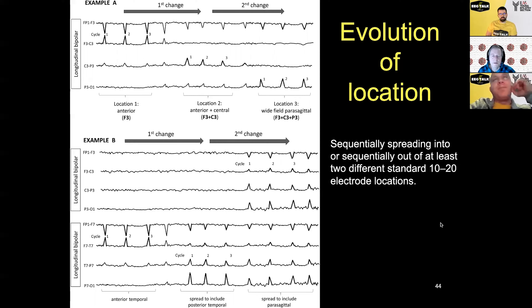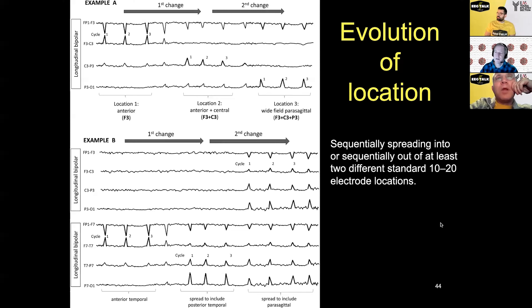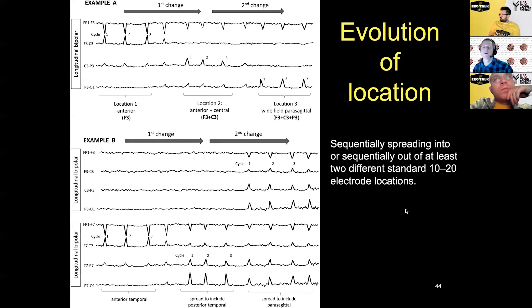Here's another example where the pattern spreads to the other side. We wouldn't automatically call it a seizure just because it's spreading, but if it does this and lasts more than 10 seconds, you would call it a seizure — even if it stays at the same frequency. The caveat is it can't just get a bigger field; it has to actually move.